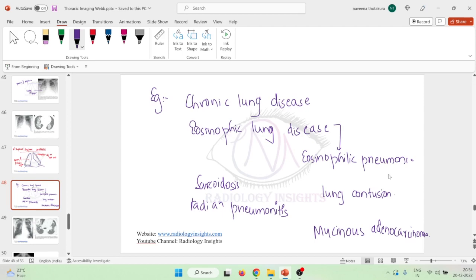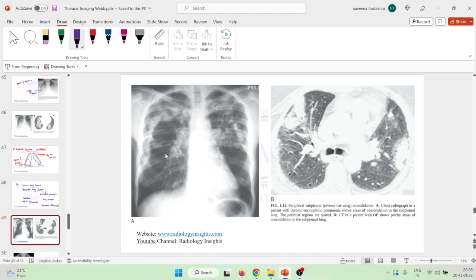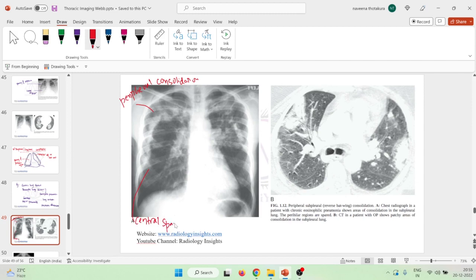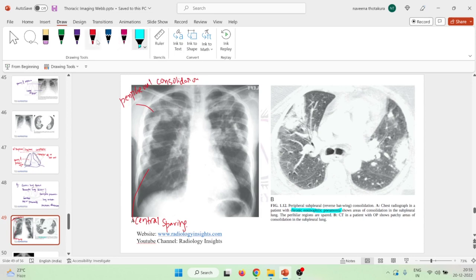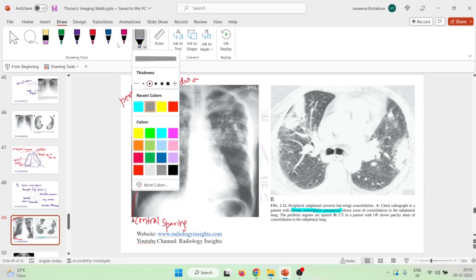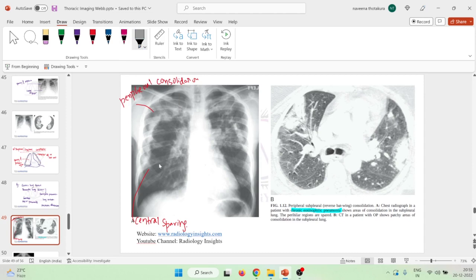Looking at the picture, you can see clearly the peripheral consolidation present here. You can see the peripheral consolidation with central sparing, which is actually seen in conditions like chronic eosinophilic pneumonia. This is a case of chronic eosinophilic pneumonia where you can see peripheral consolidation with central clearance — the reverse of the bat-wing pattern.